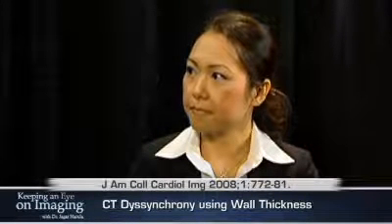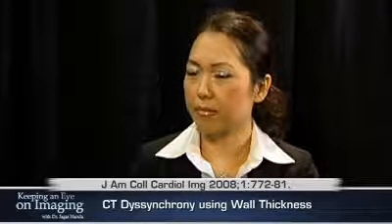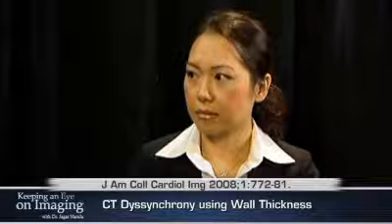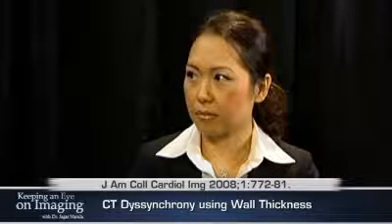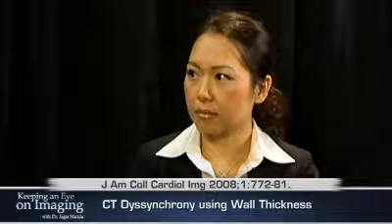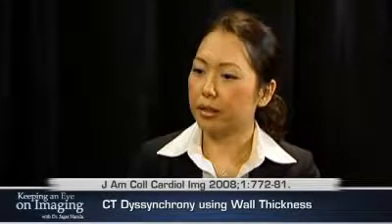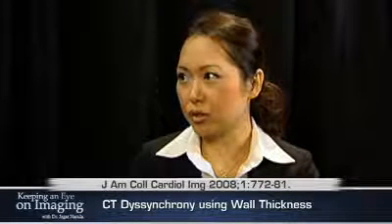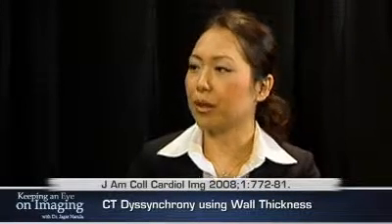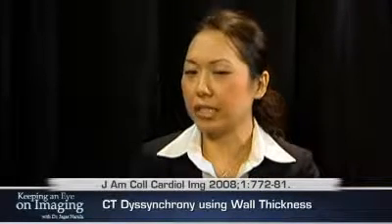Another issue that is frequently mentioned with CT is, of course, radiation exposure. And since you need to have images throughout the entire cardiac cycle, potentially radiation exposure might be high. There are radiation-lowering procedures available for CT, like EKG pulsing. Can these be used and you can still obtain your measurement, or do you have to give lots of radiation to the patients? For the functional assessment of this measure, we probably would have to use the entire cardiac cycle to get the time to peak wall thickness.